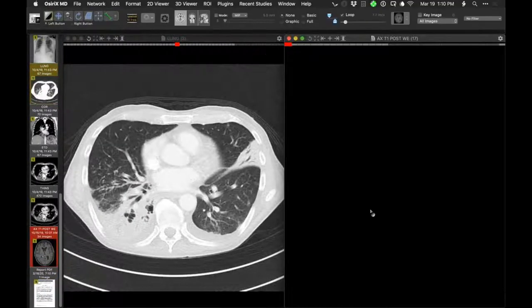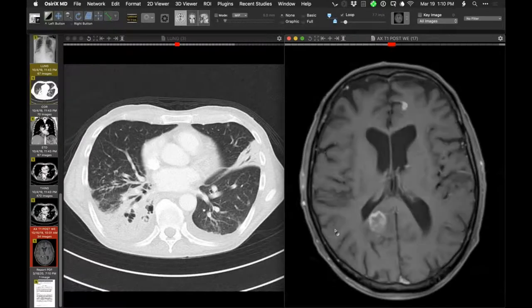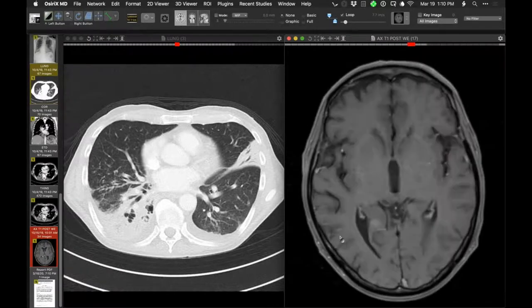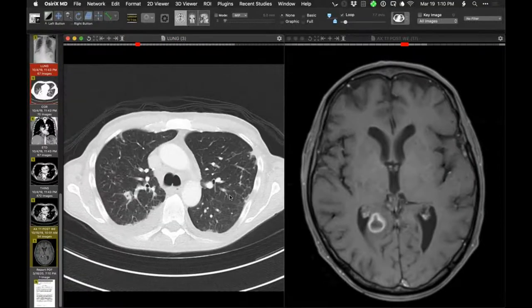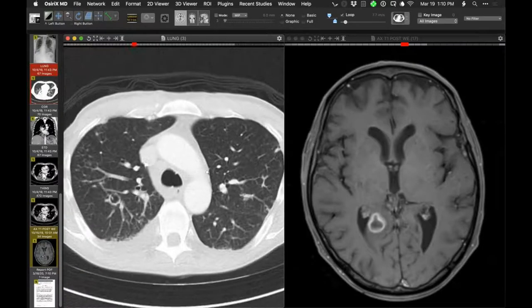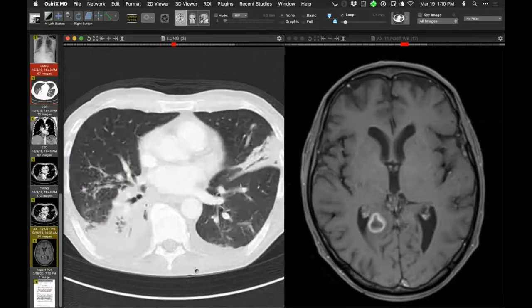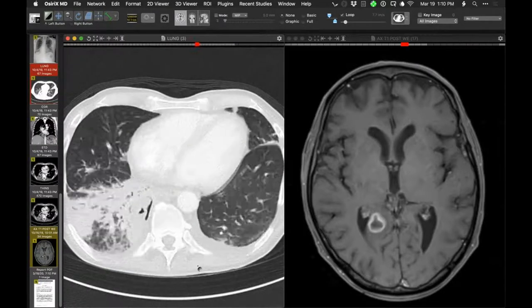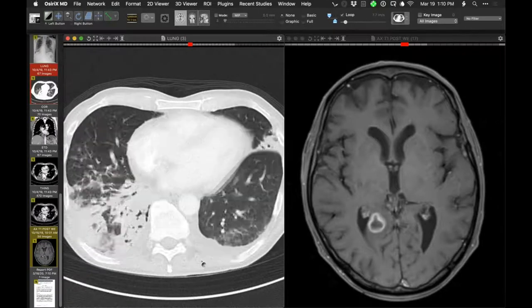I don't think it necessarily produces things that look like that. So I think the big patches, and the small airways disease, is probably the Legionella. David, the cases of Legionella micdadei you've shown in the past, I think I had one too. They look a lot like mucor, or like the big blobs. Yeah, it's often around pneumonia, but I'll take any sort of pneumonia as legitimate.